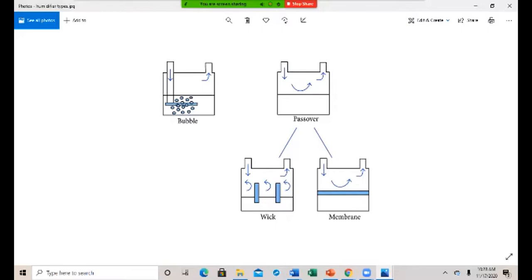And then on this side, you have a picture of the membrane type, where it's simply a paper towel type, hydrophobic membrane that separates the gas from the water, and it soaks up the moisture through here. So as the vapor and moisture goes through this membrane, it's picked up by the gas going across and goes to the patient, okay? So those are a couple types that I wanted to show you, right? So that's been recorded. All right, let's finish up.